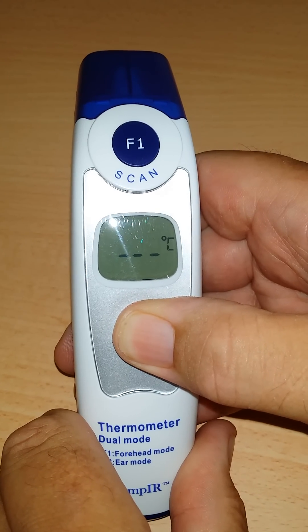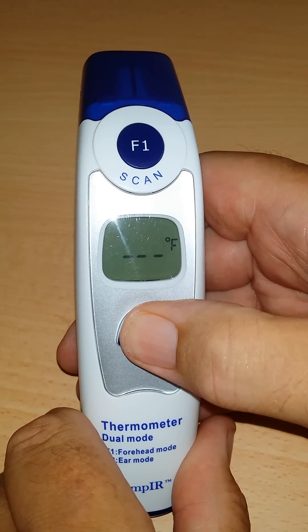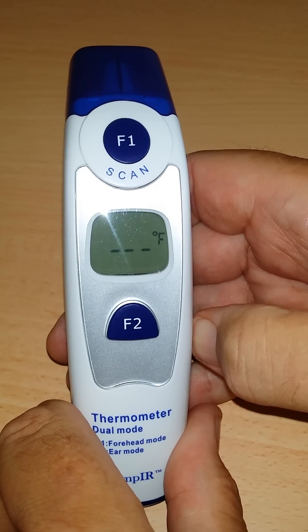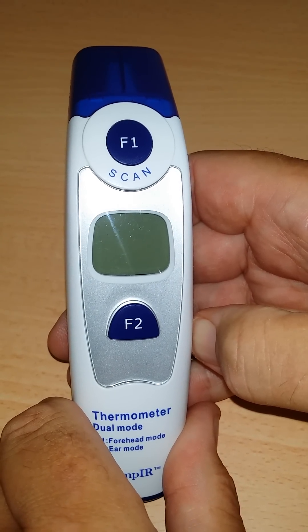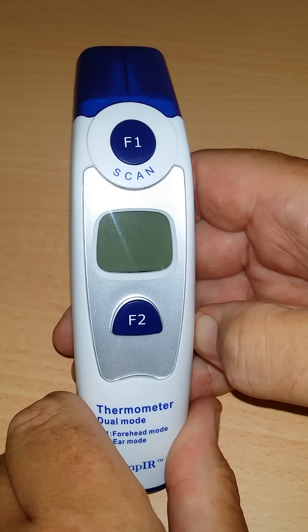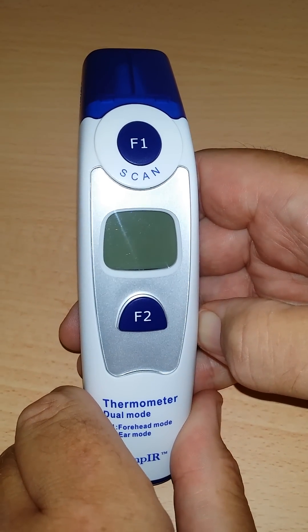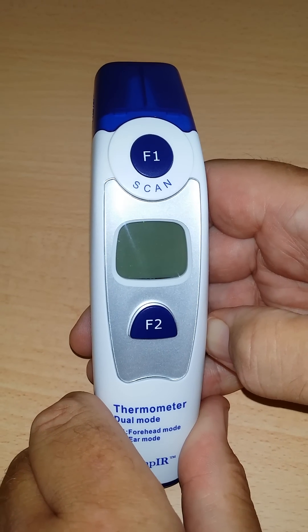To change that to Fahrenheit, all I need to do is press the button once more and then just leave it — you'll see the Fahrenheit symbol flashing there. Let it power down, and when you use it again in normal temperature-taking mode, it will read Fahrenheit.